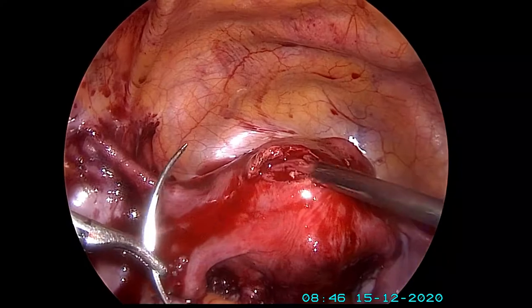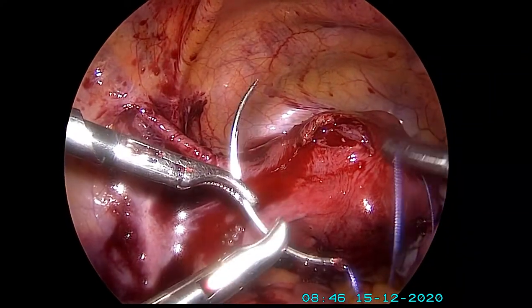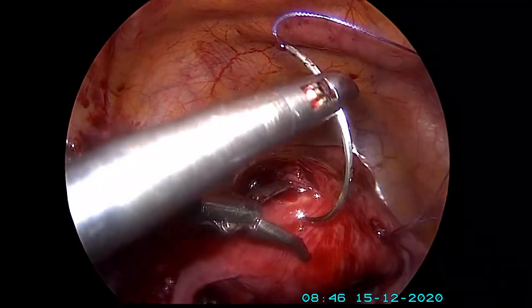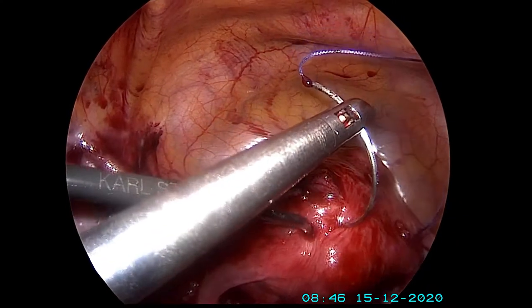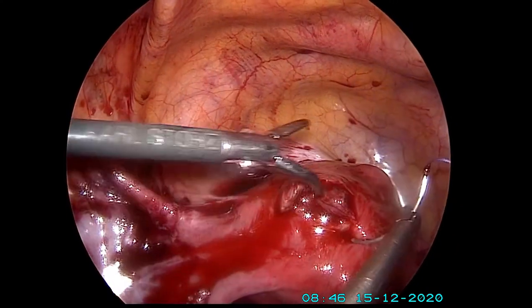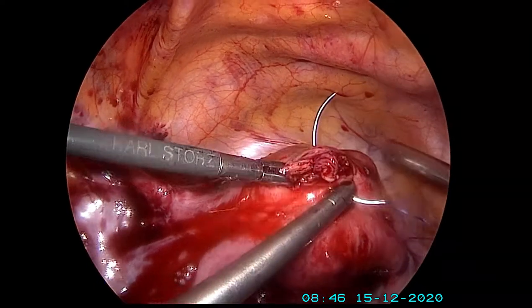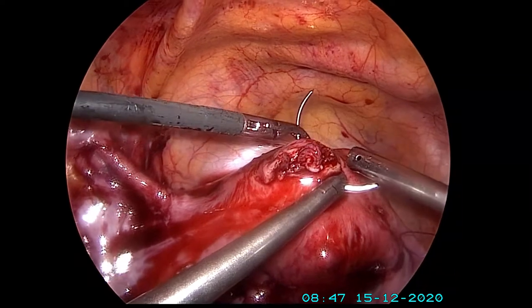This bed is now sutured so that the margins are opposed, no dead spaces are left, and healing is happening well. This woman is then ready to take on a pregnancy after three months.